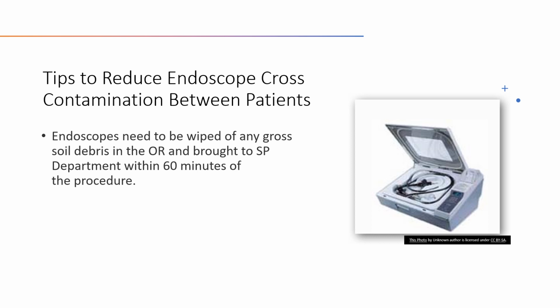It's very important for the health and safety of all of your patients and also yourself and your coworkers, because if you're giving a dirty endoscope to a doctor or to a surgical tech, you're putting them at risk as well, because you're not sure exactly what the previous patient had. But we do have some tips to help reduce endoscope cross-contamination between patients.